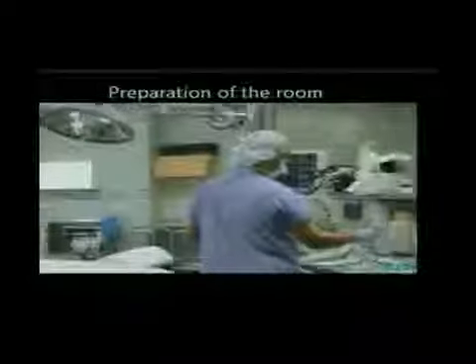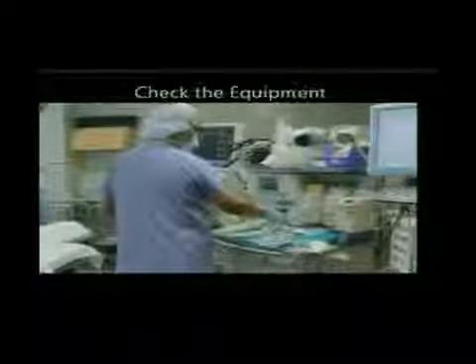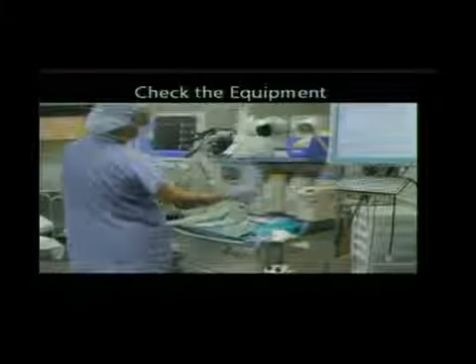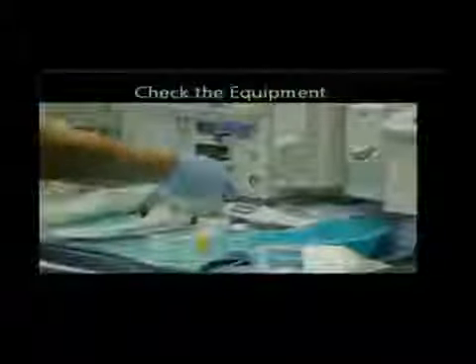Okay, so this is an overview of the administration of sedation. And the first thing you do is you have to do the preparation of the room. So at this point, Professor Hung is reviewing the anesthesia machine, checking the equipment, and going through to make sure that everything is basically properly in place.